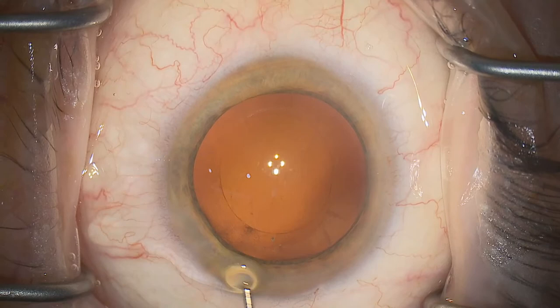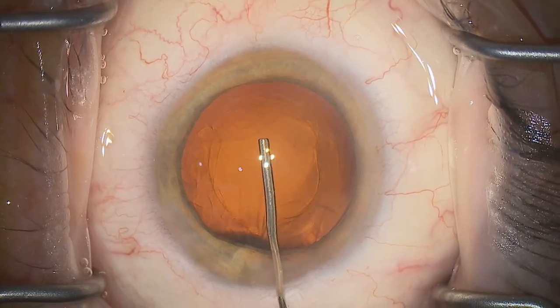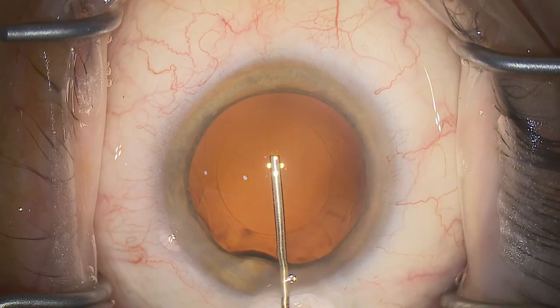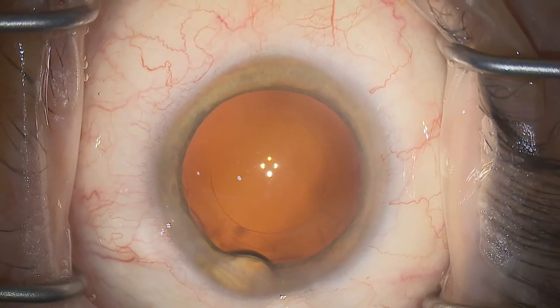Waste a bit of viscoelastic outside the eye to avoid bubbles. Inject generously into the bag as you enter — that avoids contact with the posterior capsule. Get a complete bag fill and aim to fill the anterior chamber generously, ready for lens injection.